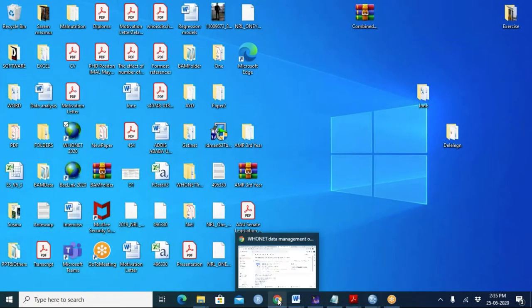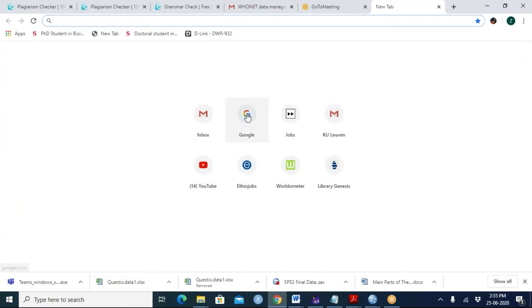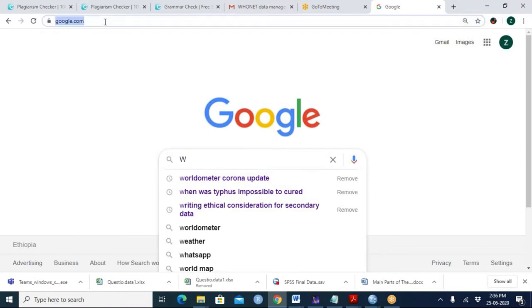From Google or? I'm sorry, what is that? I'm going to search the WHONET website. You just go to WHONET.org. There's no need to search. Just go to WHONET.org.